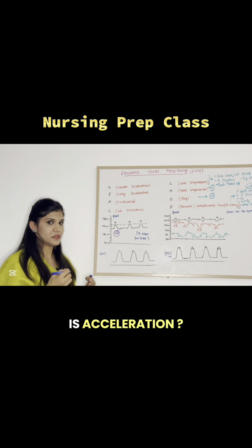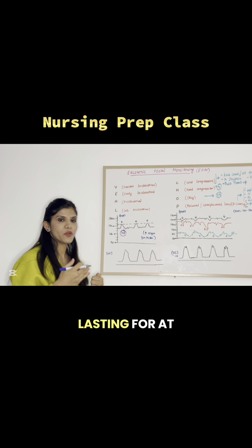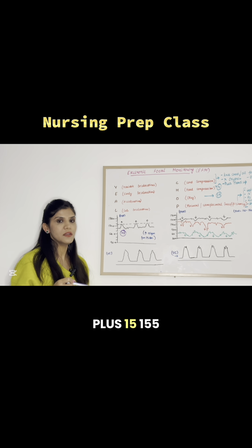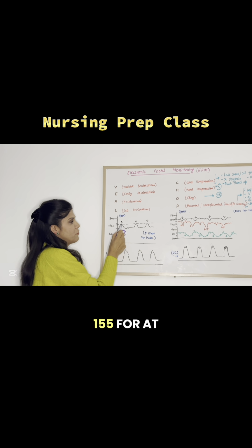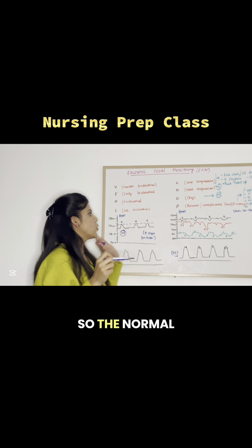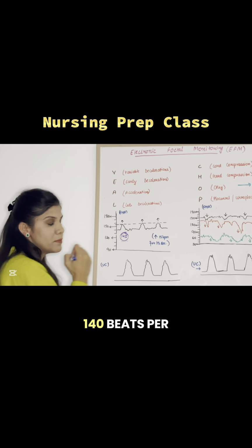Now what is acceleration? Acceleration means an increase in the fetal heart rate by 15 beats per minute, lasting for at least 15 seconds. In this case, the heart rate will increase from 140 by 15 beats per minute. That means 140 plus 15, 155 beats per minute, and it will stay on the line of 155 for at least 15 seconds before it starts coming down to the previous baseline. The normal fetal heart rate is 110 to 160 beats per minute, and here we have a baseline of 140.